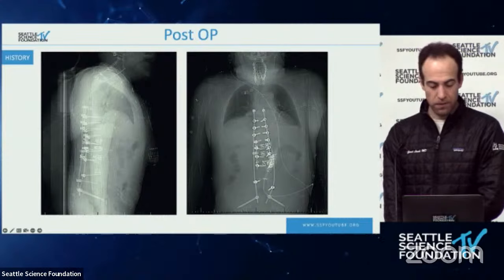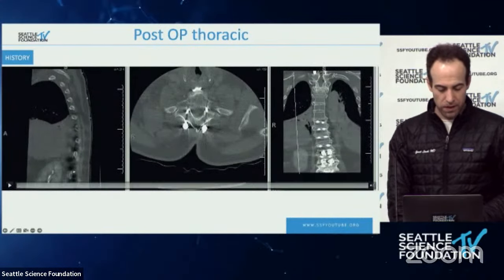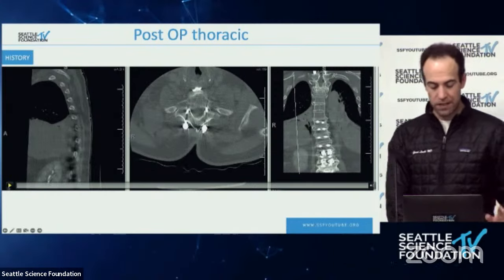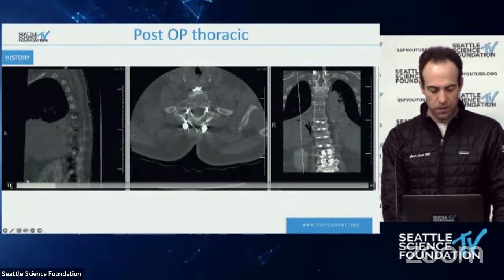This is like the first, like the scout views, and this time we don't have a full spine CT, but we have a thoracic and a lumbar. And you're right, Dr. Chang, there's no infection that we could see. We treated it like an infection. We have the thoracoscopy, irrigators, we wash out everything. Dr. Oskouian came in and we actually did this together, and I'll ask him for his opinion about this case.